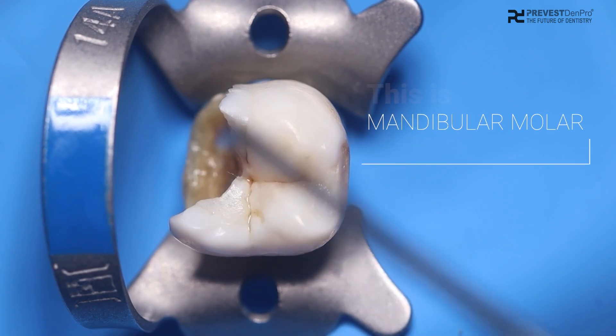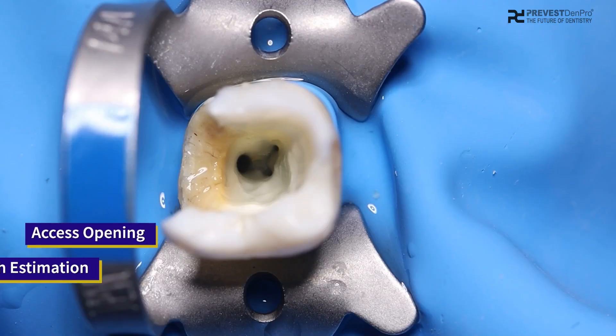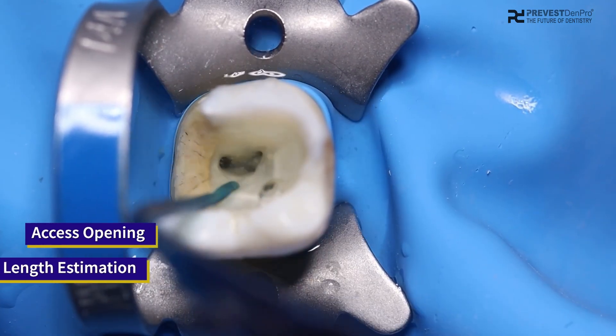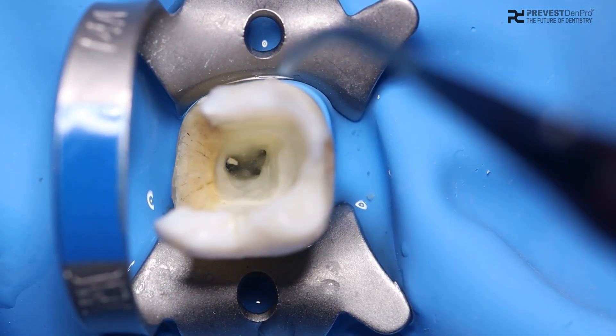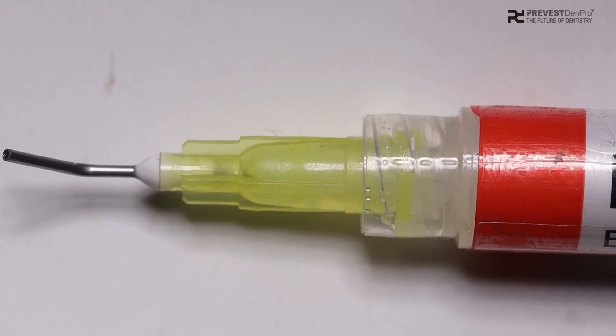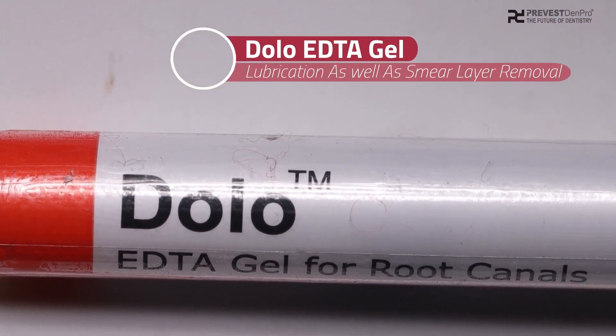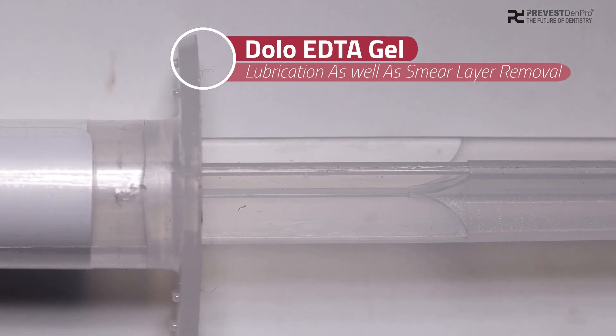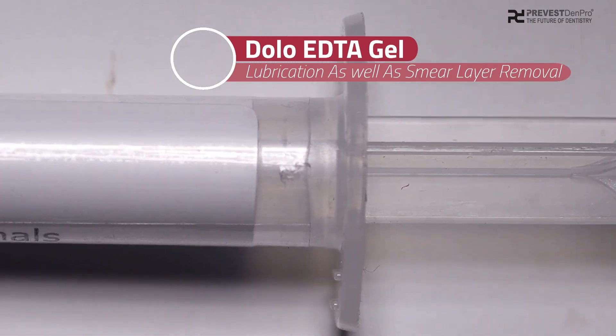This is the mandibular molar in which we did access opening and estimated the working length. Now we are ready to prepare the canals using the chemo-mechanical method. For this, we are going to use Dolo, which is an EDTA gel for root canals that aids in lubrication as well as smear layer removal.